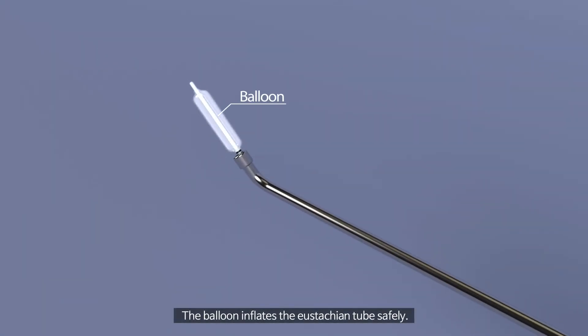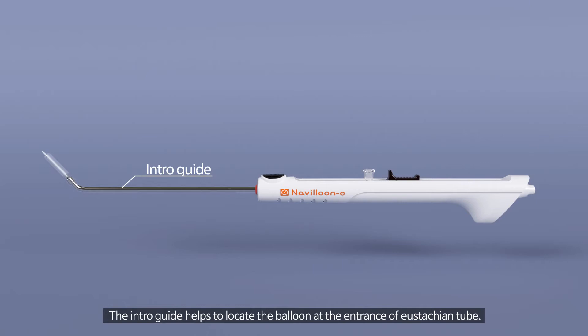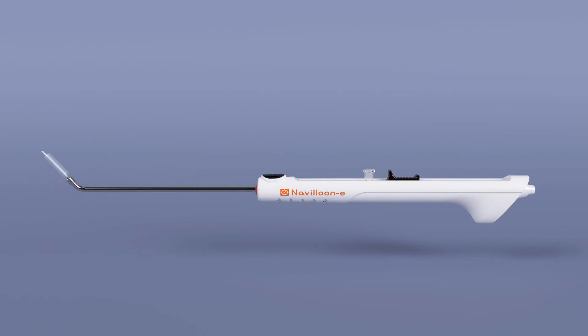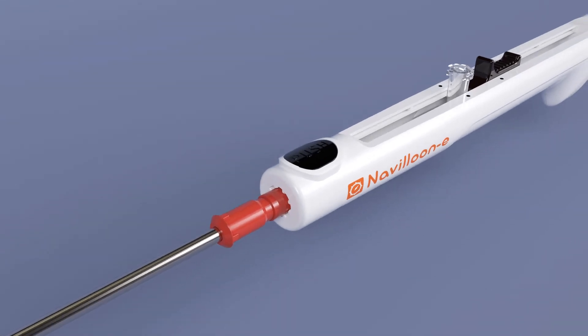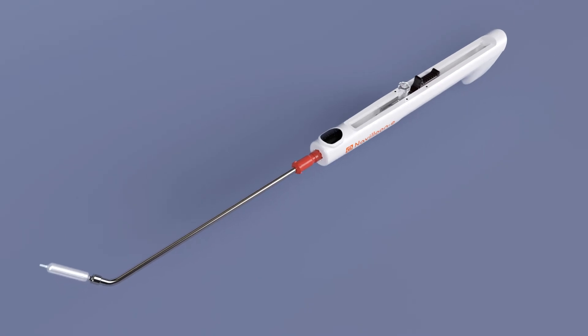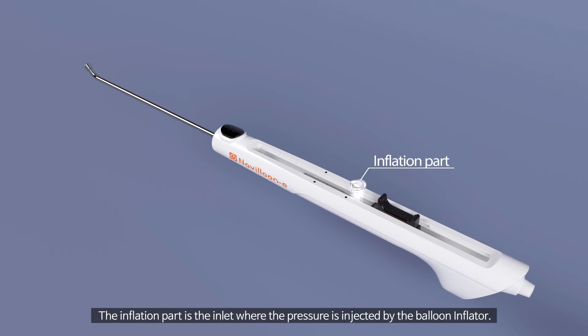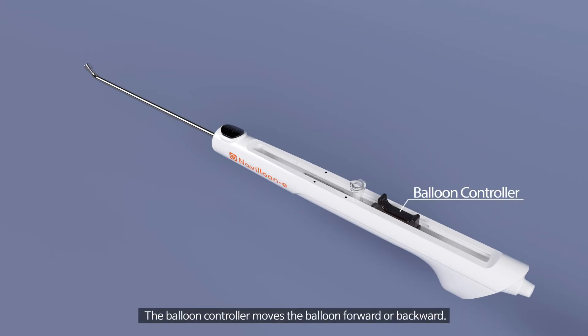The balloon inflates the Eustachian tube safely. The intro guide helps to locate the balloon at the entrance of the Eustachian tube. The rotation button enables changing the angle of the intro guide. The inflation part is the inlet where the pressure is injected by the balloon inflator. The balloon controller moves the balloon forward or backward.